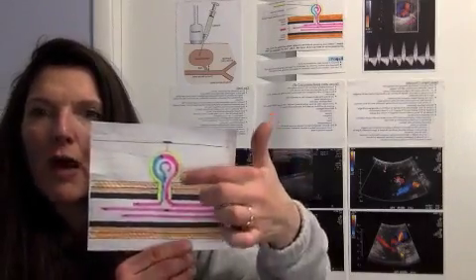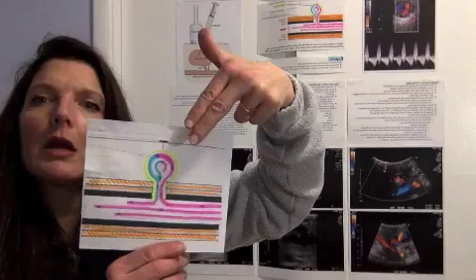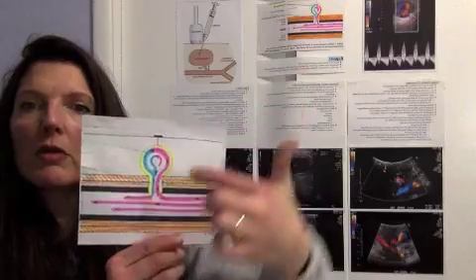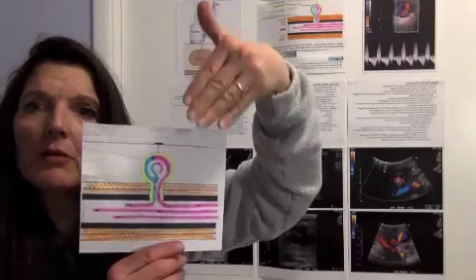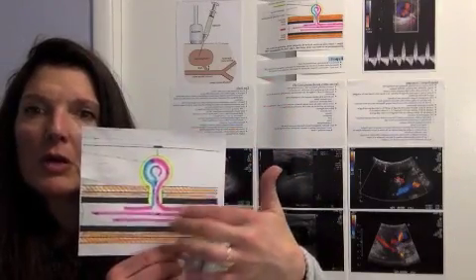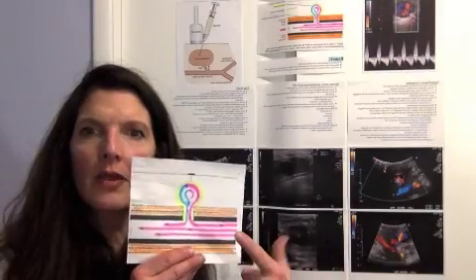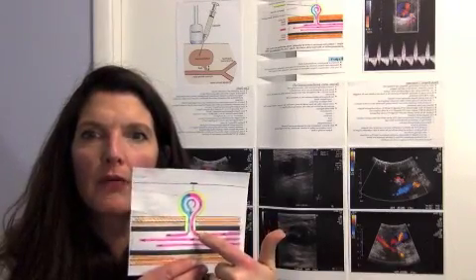And so when you're looking with a transducer, you'll typically see a yin-yang pattern of blood flow, so that the red, where the ultrasound beam is coming in and the blood is coming towards the ultrasound beam, is red, and where it's going away, it's blue. So that's a telltale sign of a pseudoaneurysm. The neck portion will typically display a to and fro blood flow pattern.